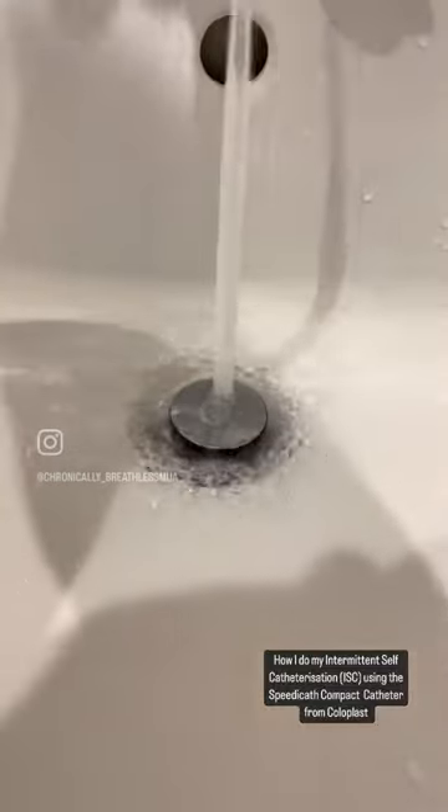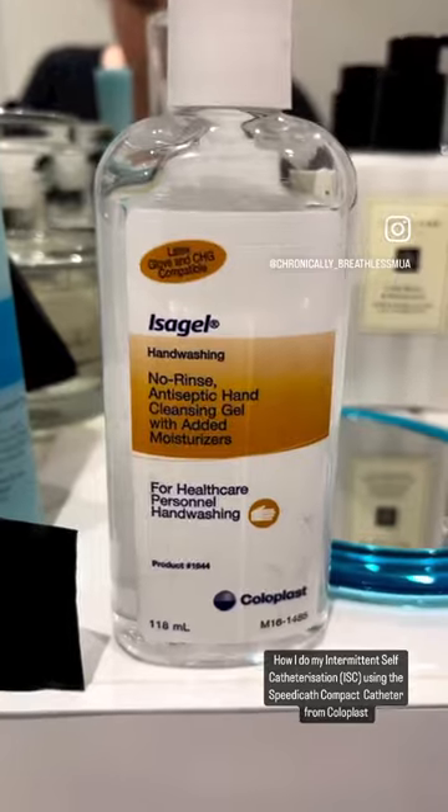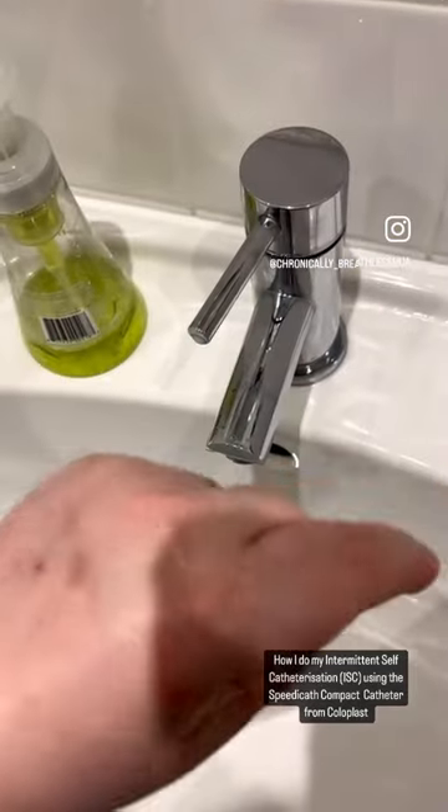Make sure the area where you're going to do this is completely prepped and clean. Grab a wipe, clean down below, then apply some gel on your hands to refresh.